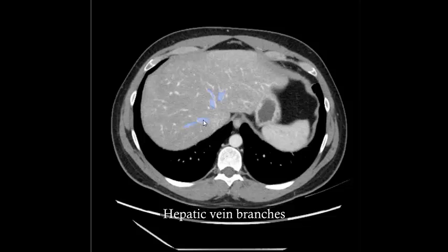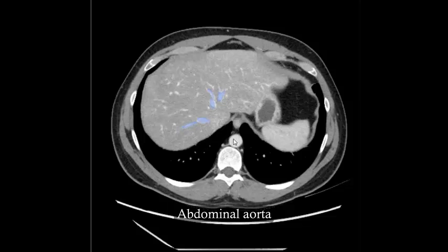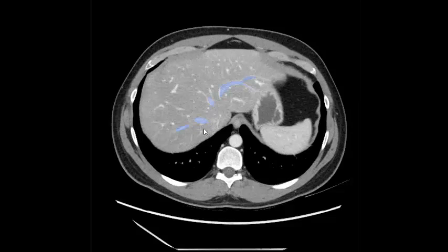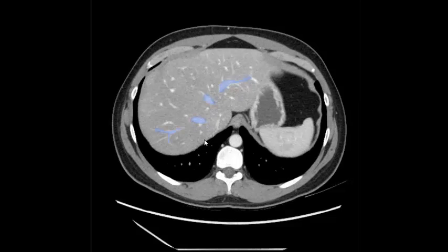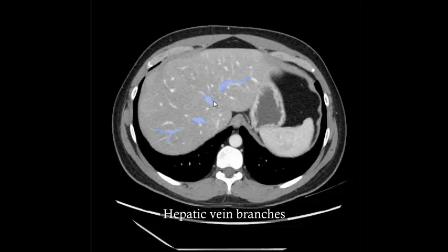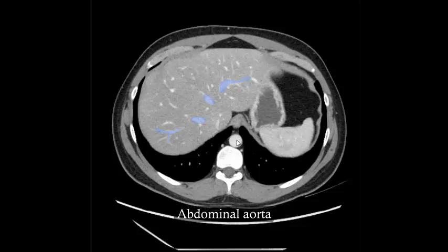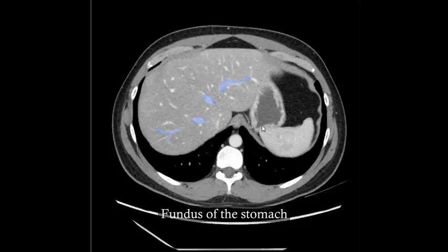Hepatic vein branches, abdominal aorta, spleen, fundus of the stomach.